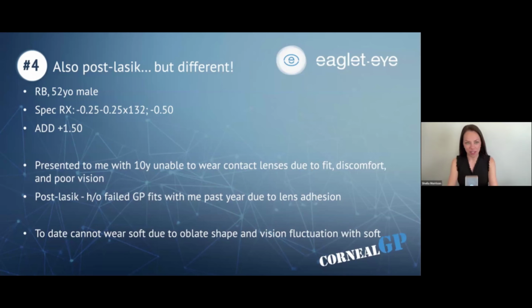So you'll see my theme for today appears to be post-refractive, and it really is with this next case. I am going to switch gears now and move into corneal GPs. We will go through a couple of very quick examples, not a lot of detail on these cases, because the whole point of sharing these is to talk a little bit about how the process of fitting corneal GPs can be very analogous to OrthoK and sclerals, diagnostic versus empirical fitting.